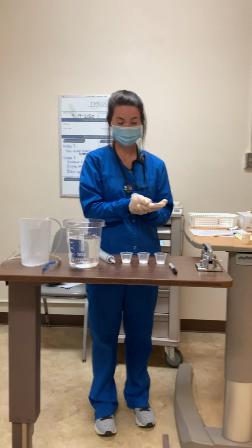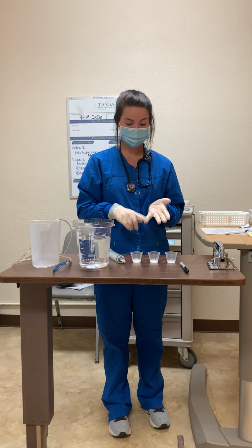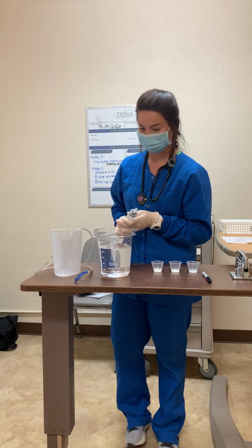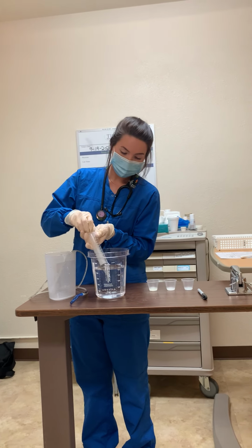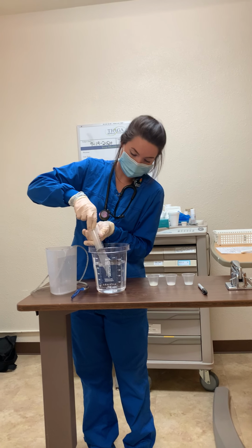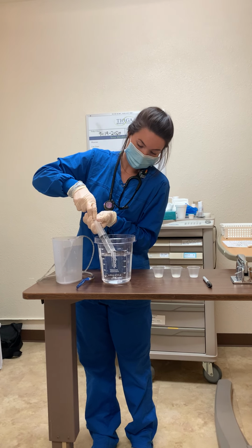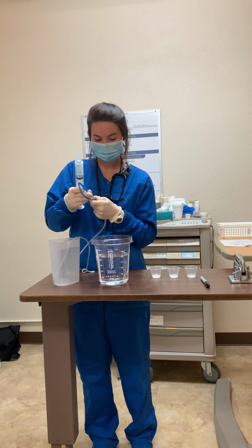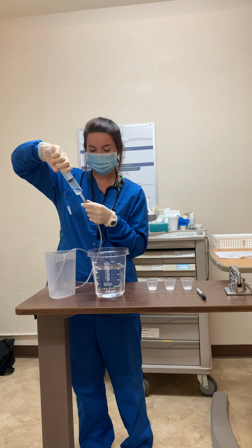So then after I did that, then I would go to Joanne's room, do my hand hygiene, change my gloves again. I'd ask Joanne her name and date of birth, her allergies, her pain, and then we'd be able to administer her medications. So first you're just gonna draw up 30 to 60 milliliters of water. And you're just gonna flush the tube here first. So under your end.